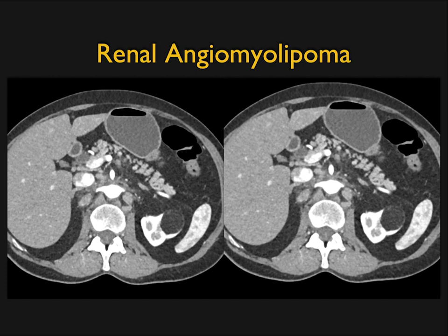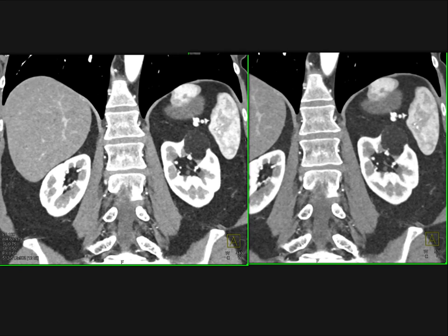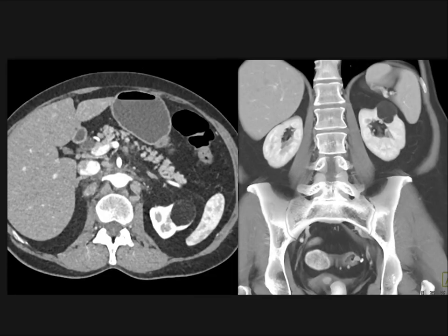If a lesion contains fat, the diagnosis is easy. Here's a large angiomyolipoma with lots of fat on axial and coronal images. You can also see dystrophic fat in a large aggressive tumor invading the perirenal space. We see many smaller angiomyolipomas as well — nice septation, fat density, no problem. Easy to make the diagnosis. So those are the key points for the kidney: 25% of renal masses under 4 cm that are resected are benign because people don't think about high-density renal cysts.